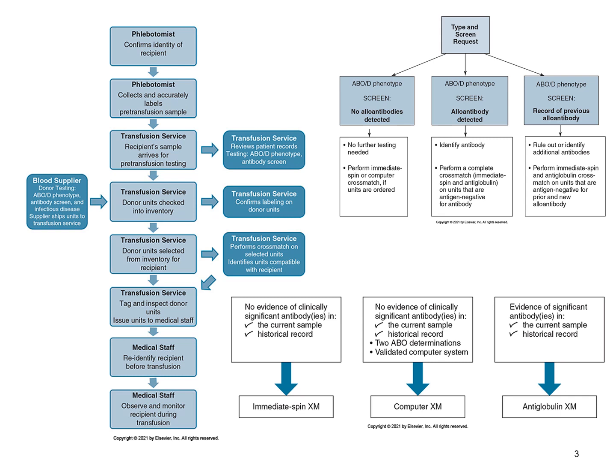So the phlebotomist or nurse or whoever is responsible for doing that collection will confirm the identity of the recipient. So you'll do the checks that happen with those pre-transfusion or pre-analytical steps where the sample from the patient is being collected.